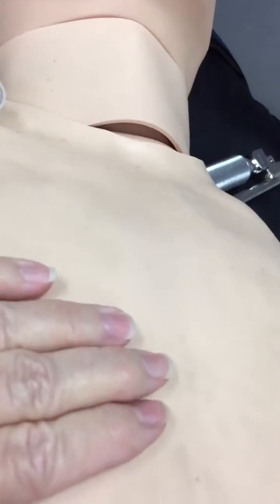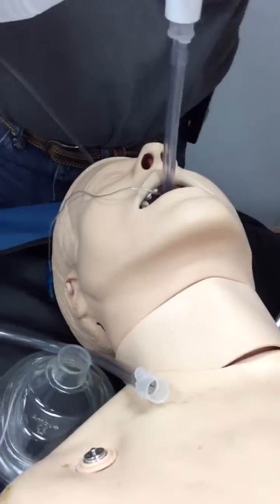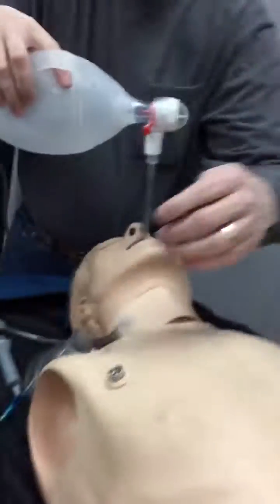I'm looking for chest rise and fall, which I have bilaterally. I am listening for bilateral breath sounds to make sure that I have good tube placement here, here, and in the mid-axillary areas as well.